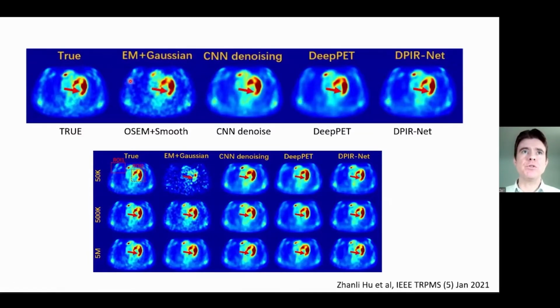Now what we're doing is comparing the DeepPET result with conventional reconstruction and conventional post-reconstruction denoising. Their method, using that discriminator and perceptual loss as well as the mean square error, delivers these, hopefully you can see, improved images compared to the rivals. Maybe it's best seen here, where we're dealing with low count data. So here is the ground truth reference for that. I think this was simulated data, but based on real.